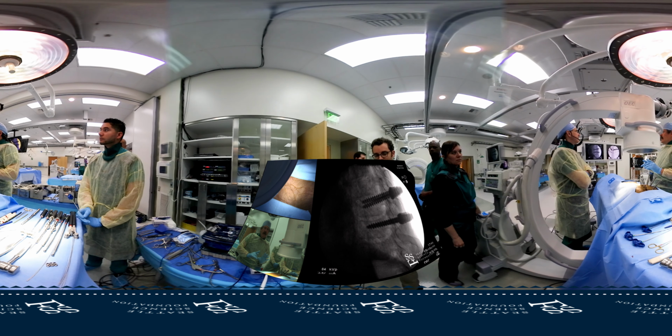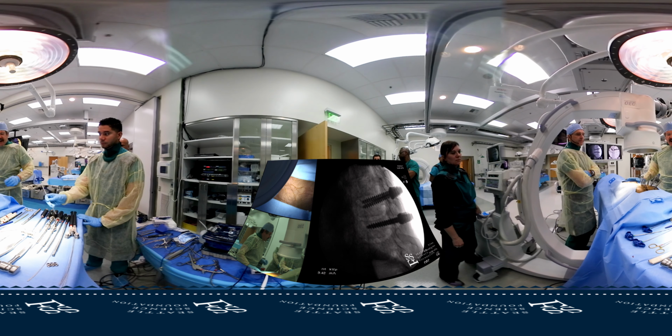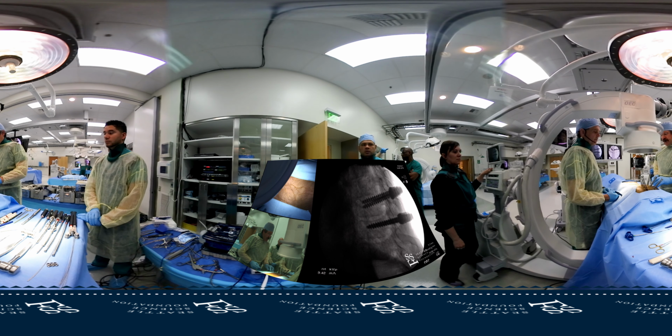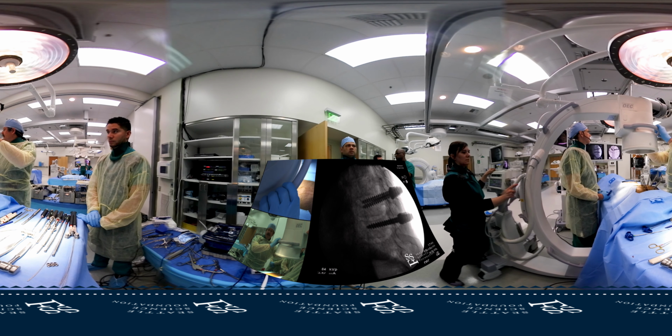So I've already put 6 of the screws in, and so I'm going to show you our workflow for putting screws in, but we're going to put the last screw in with workflow. And I have an example. I have one that's a little medial that I want to show you.